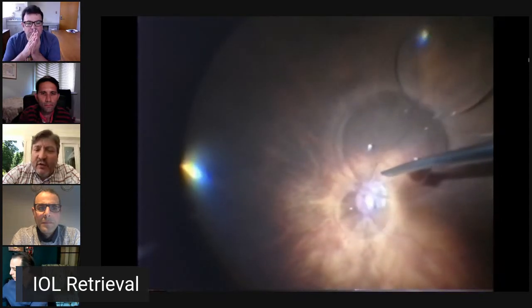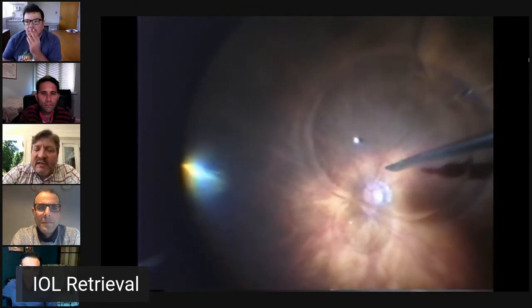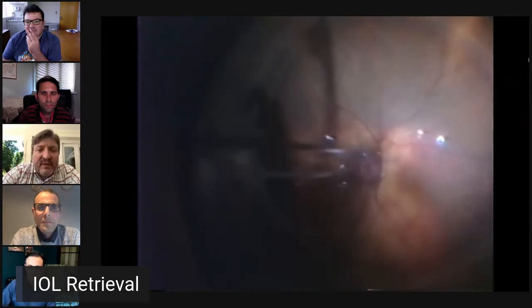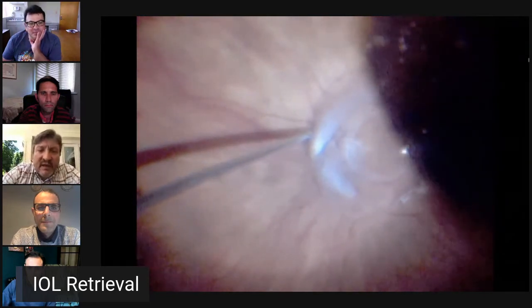And this video is 15 years old. You see it's standard definition. And I'm doing this case 25 gauge, and this is before we had 25 gauge dual bores. I'm using perfluoron and a forceps, taking the lens and floating the lens up. That's the old-fashioned way to do it.